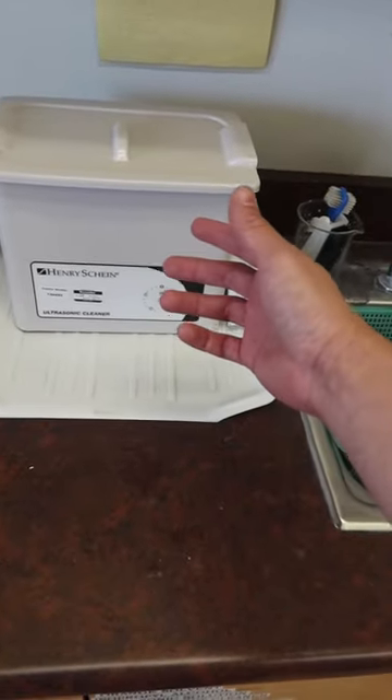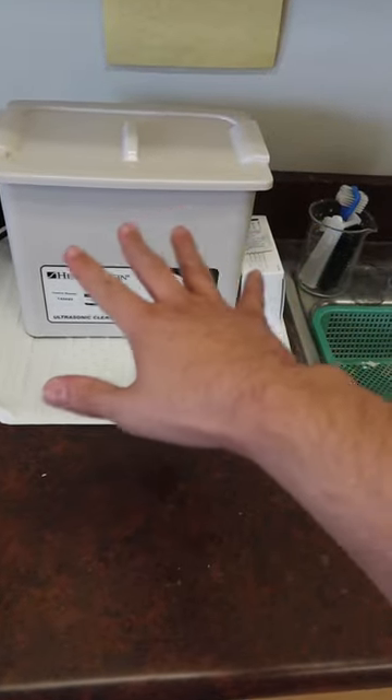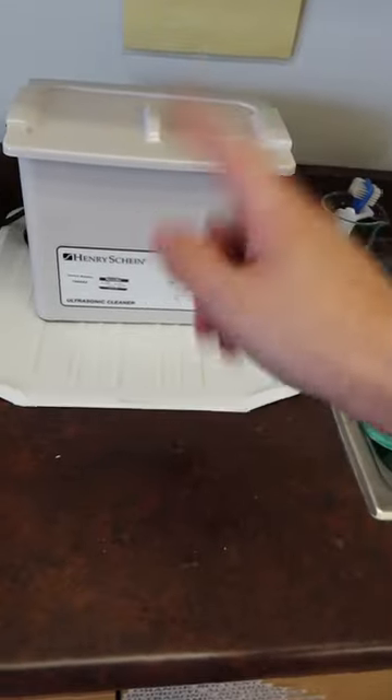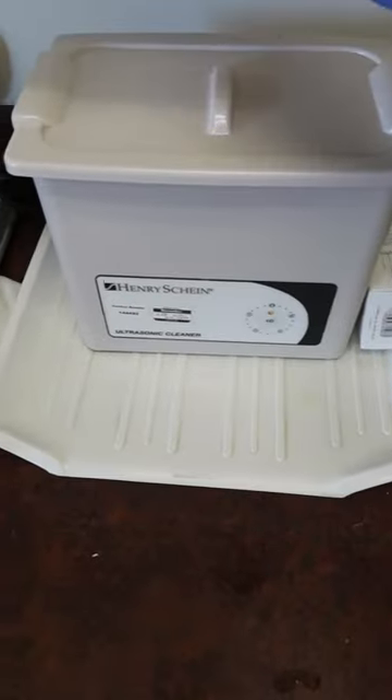We're going to talk about the ultrasonic unit and how we're going to use it. Before we use it, we need to glove up because right now we are on our dirty side. Make sure you're not touching anything over here — no glove, no love. Always be prepared with gloves so that you're ready.